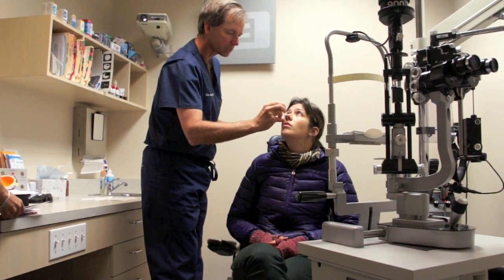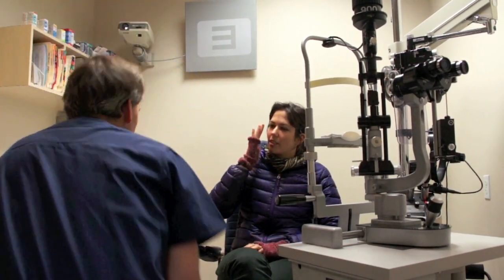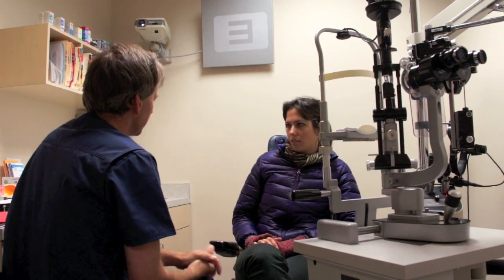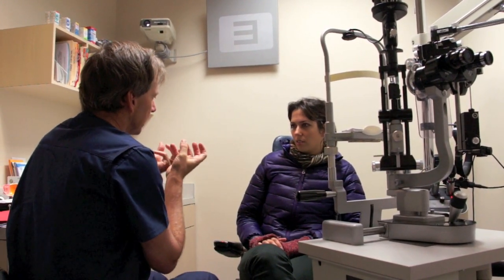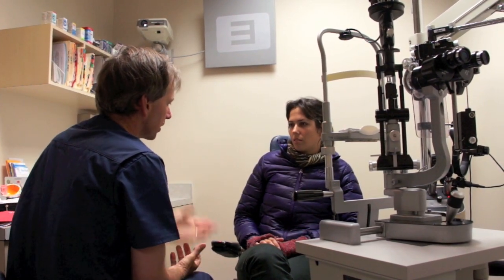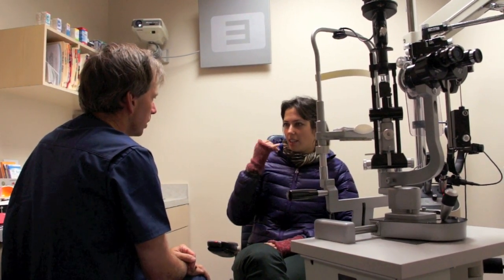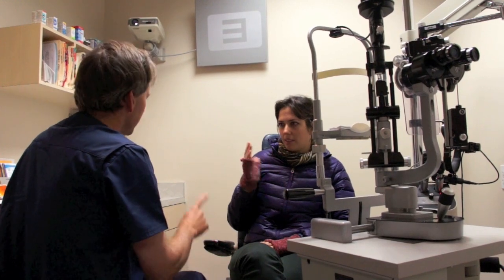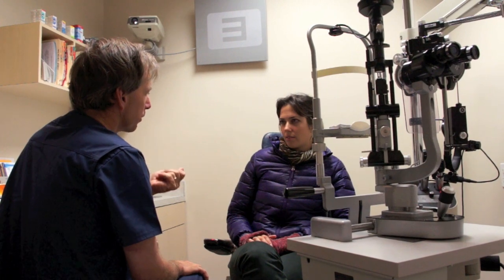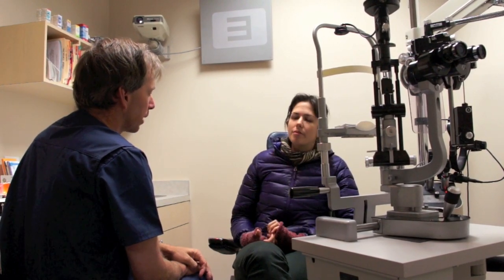How do you reattach the flap? There's a space for it, but it's more just like a piece of a puzzle. There are endothelial cells on the underside of the cornea that are responsible for pulling moisture out of the cornea — that's how it keeps it clear normally. It's like a natural little suction device. So you don't have to reattach it anywhere? No, we don't have to put any sutures or anything like that. It is important to keep the eyes moist — if they get dry, even just blinking or closing your eyes could potentially move the flap a little bit.